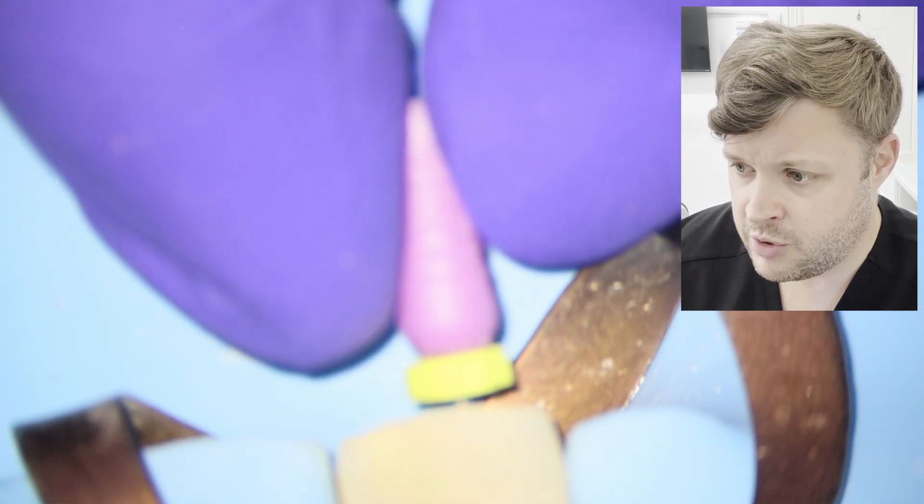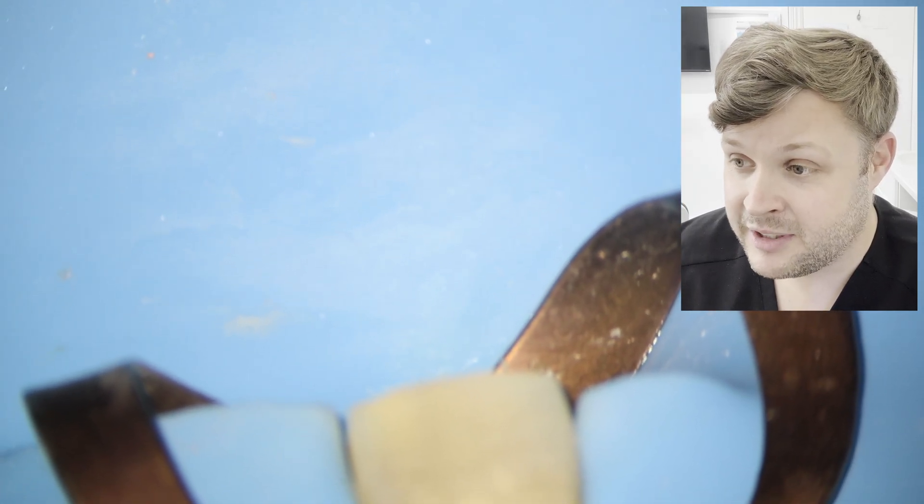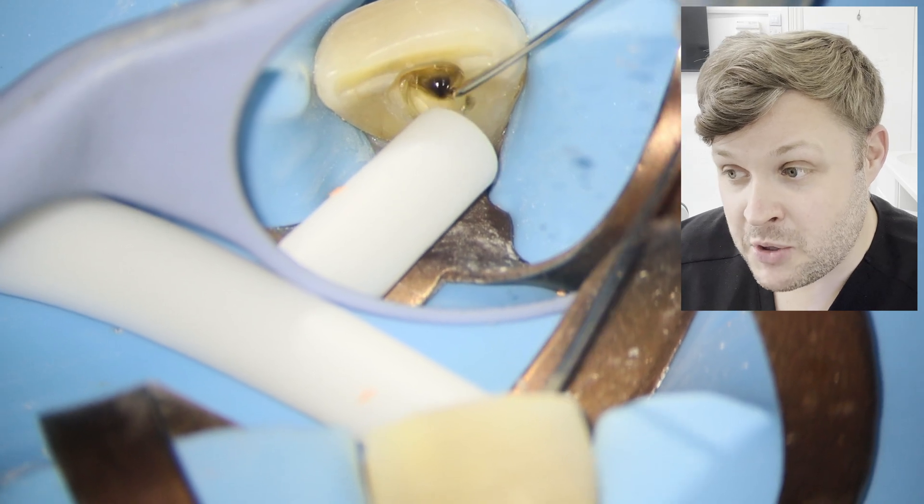I'm to length now and just very gently opening up the apical third of the tooth ready for my master apical file. I have forgotten to take a video of my final shaping, which in this case isn't a lot because most of the canal wall has been shaped already. Really what I'm doing is shaping just the very final apical third of the tooth. With that done, we're now going for the cone fit radiograph.